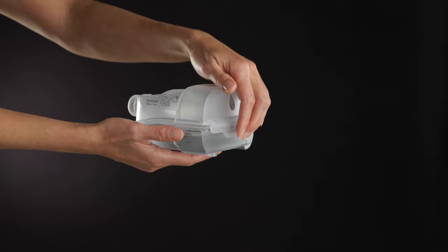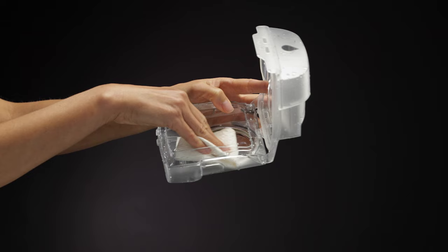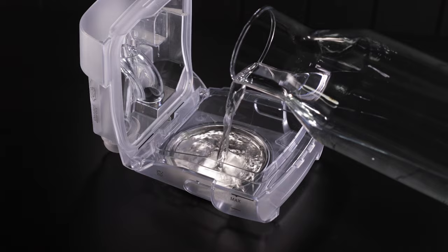Daily cleaning. Empty the humidifier tub and wipe it thoroughly with a clean disposable cloth. Allow it to dry out of direct sunlight. Refill the humidifier tub with distilled water.